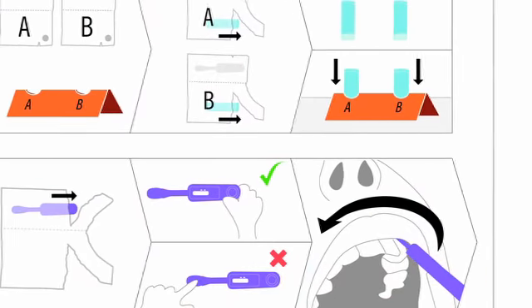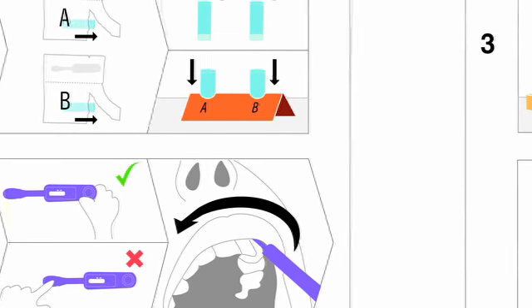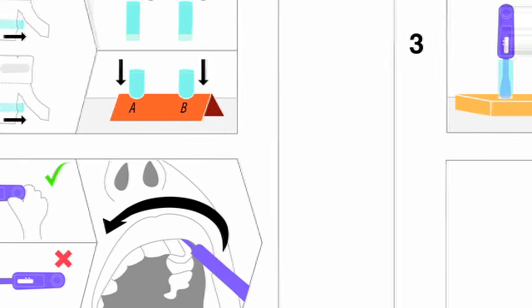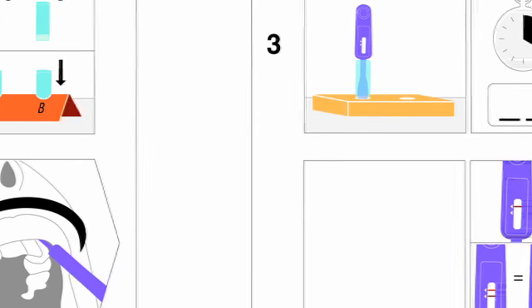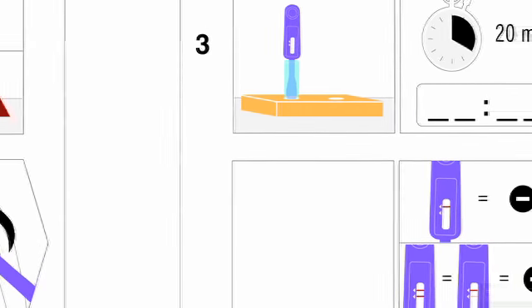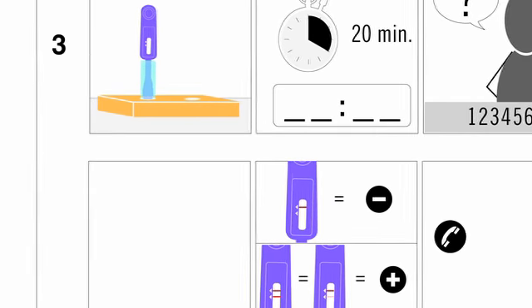Once we had gotten through the initial form, the function, and how this thing would behave, we could start with the graphic design, the outer layer of that. At which point it became an exercise around how we could create a very simplistic step-through process, analogous in many ways to airline safety manuals, where you're really taking the user through a series of simple steps to achieve a specific goal. This is a relatively complex goal in the sense of what a positive test means, what a negative test means, and the different steps that you have to go through to get to it.